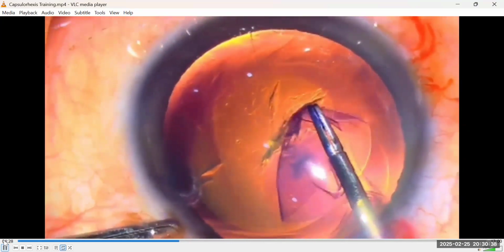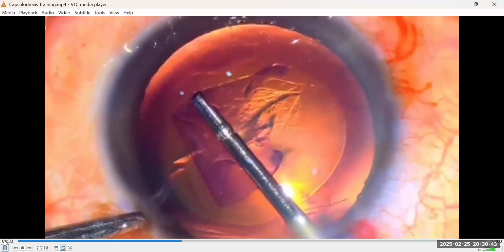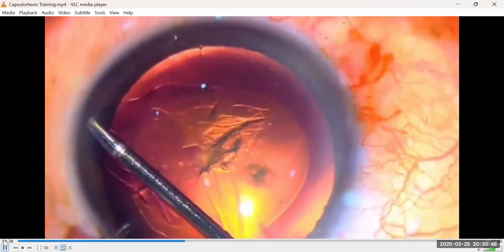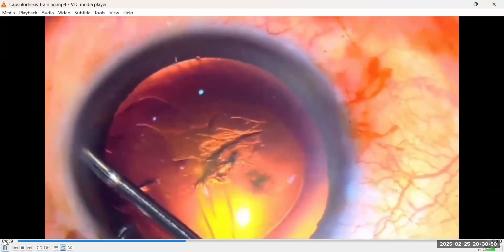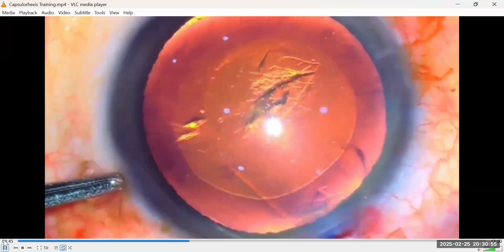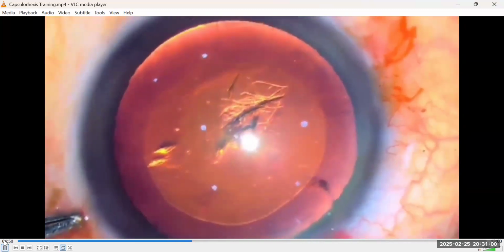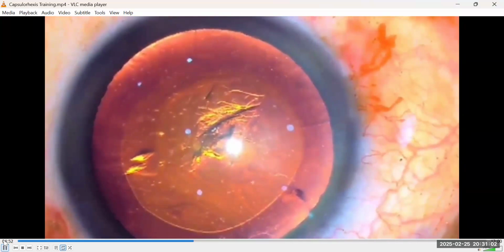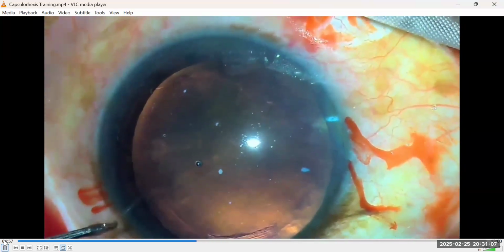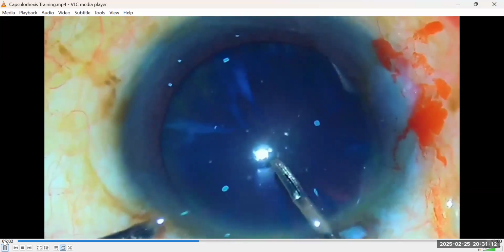So this is centripetal, centripetal, centripetal. So in a good capsulorrhexis, only you, the surgeon, should know when you switch from circumferential to centripetal. It is a seamless blend. Yesterday we talked about the area of attention in rhexis, and I said the area of attention in rhexis is at the point of the tearing, at the point of the rhexis. Let's look at this, okay?